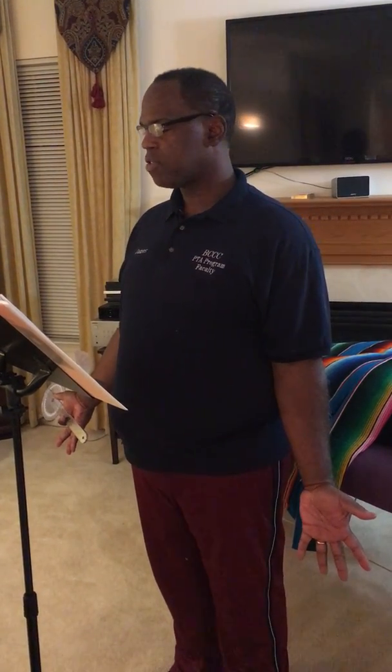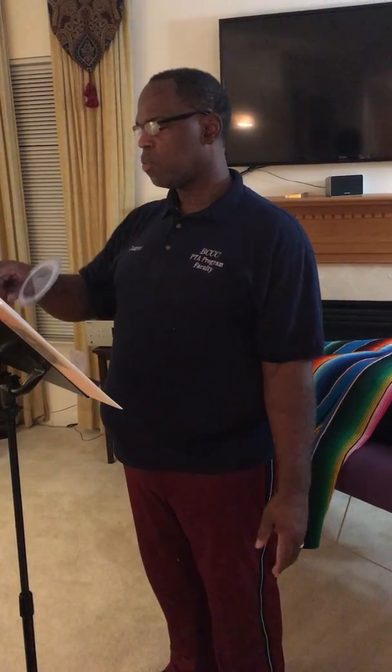The neutral position is the starting position for measuring joints, usually but not always corresponding to the anatomical position. So if we're making reference to the anatomical position, this is what is considered that. However, we'll look at some exceptions noted there on page 14: shoulder and hip rotation and forearm pronation and supination, meaning we need to take the body part out of the anatomical position for measurement.